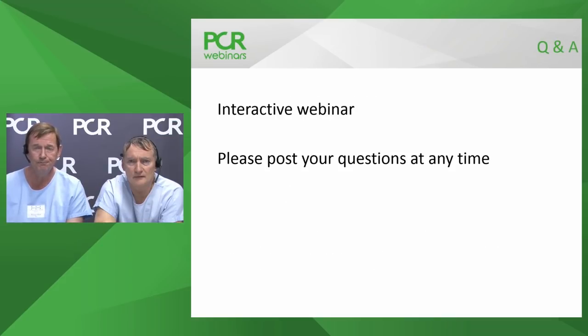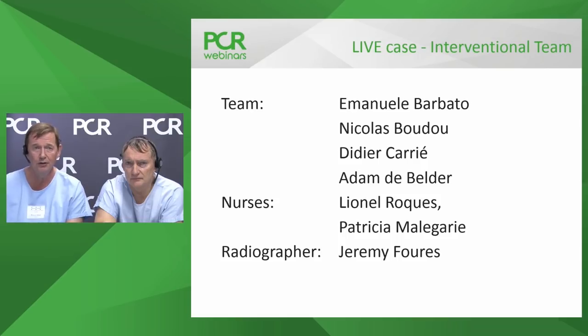This is an interactive webinar, and I hope very much you'll be able to ask your questions at any time, which will flash up in front of us. As they come through, we'll try and answer them in a timely way, hopefully relevant to the timing of what's going on in the case.